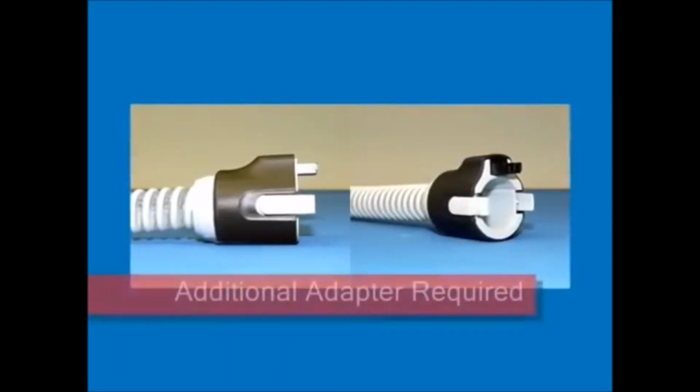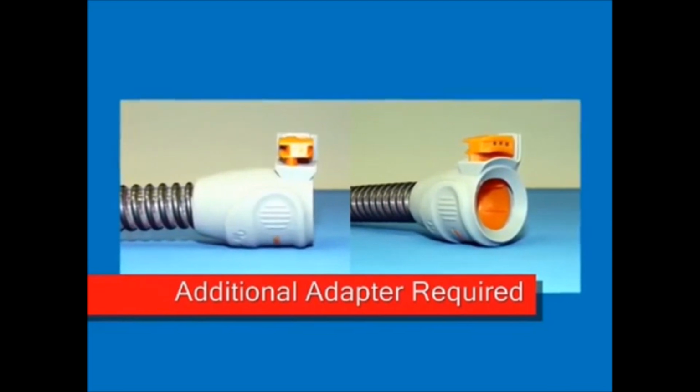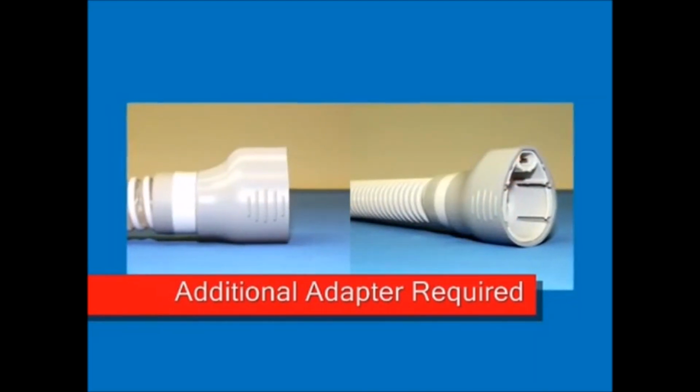If you have a heated hose that connects to and is powered by your main CPAP unit, you'll need a special adapter to continue using it along with the SoClean.